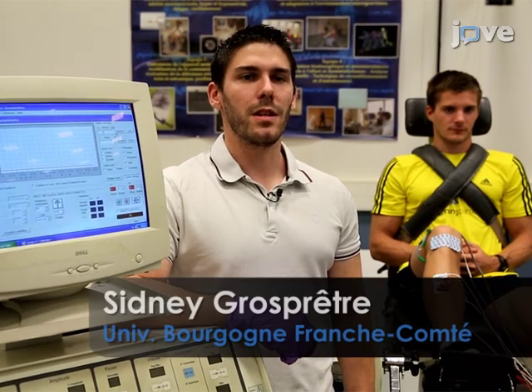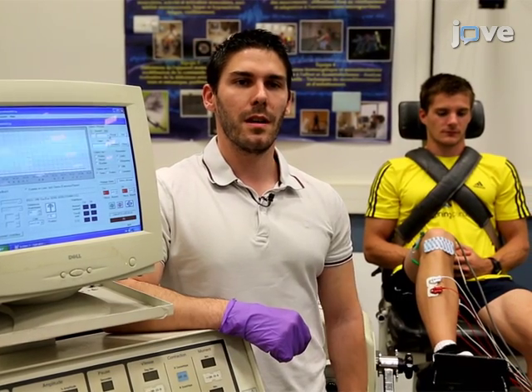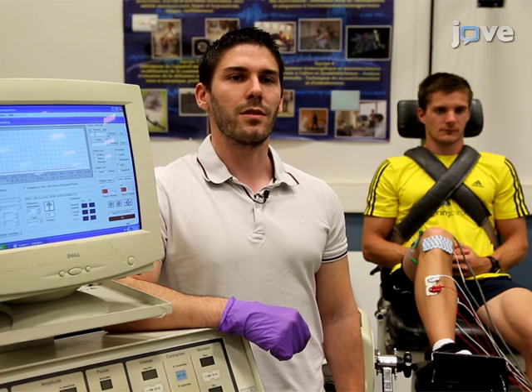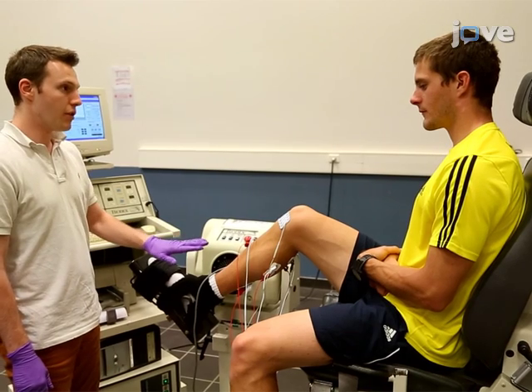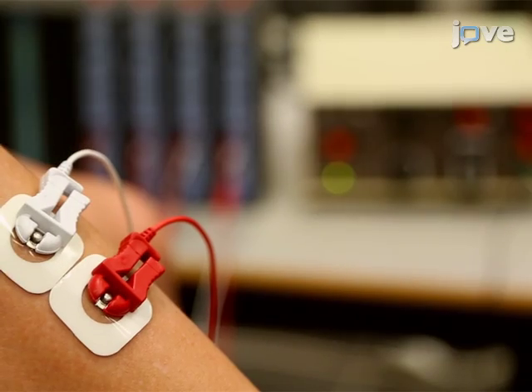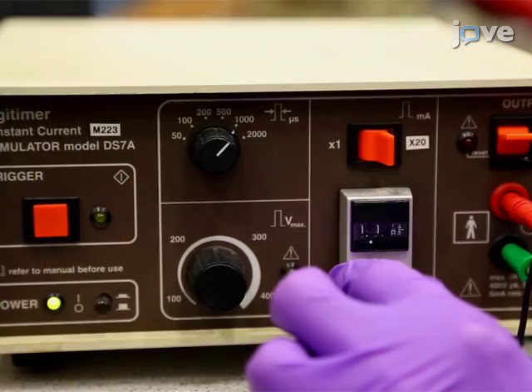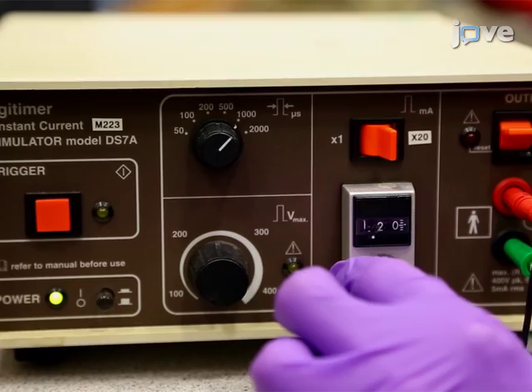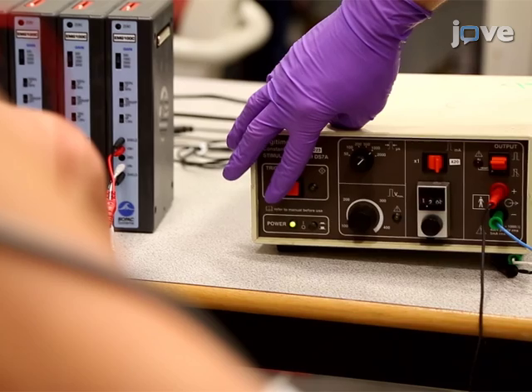None of these parameters should change for the assessment of the different electrophysiological measurements. Only the intensity of the stimulation and the condition should vary. Before starting the test, instruct the participant to relax and keep their muscles at rest. Set the stimulation intensity to obtain a maximal soleus H-reflex amplitude, which usually ranges from 20 to 50 milliamps. Using 1 millisecond pulses, record at least 3 soleus H-reflex responses.